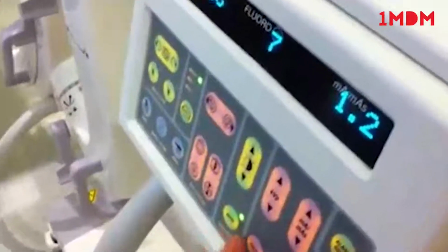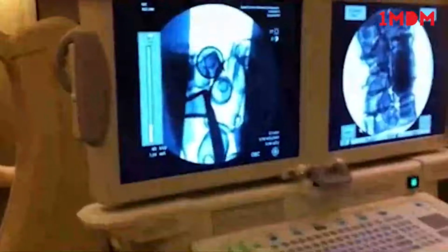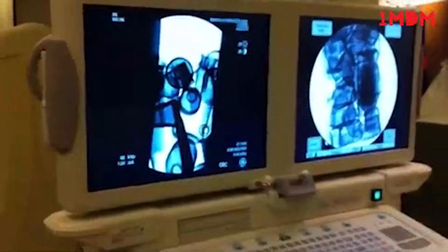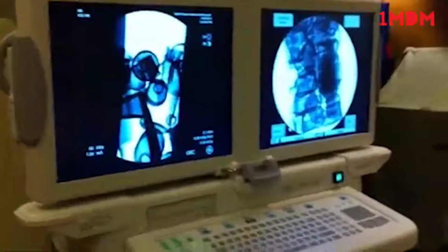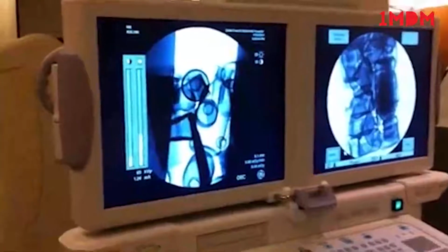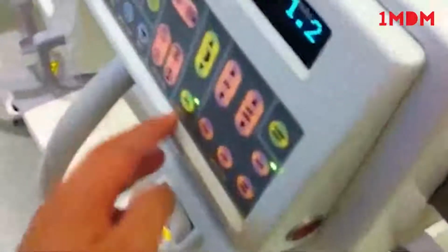This is for contrast, automatic control of the brightness and contrast. If you start pressing these, it will bias it. Basically, you can control the kind of bias that the machine wants to lean towards. It'll keep it automatic, but you can have it go naturally a little brighter or a little bit darker. If you turn off the automatic here, you can manually control brightness and contrast. Okay, right there. Here we go, turn it back on.